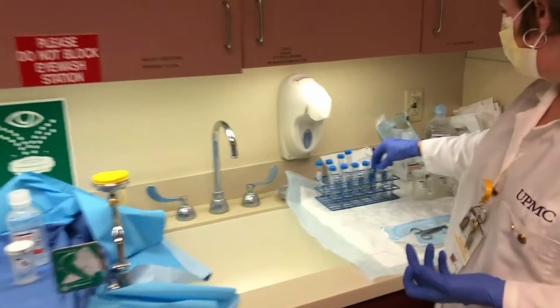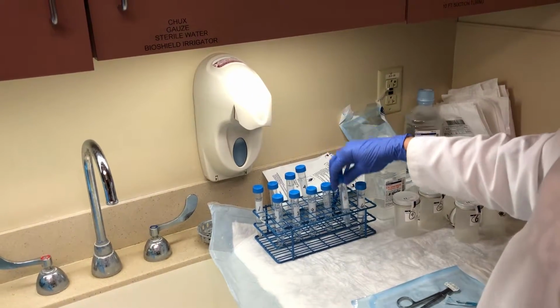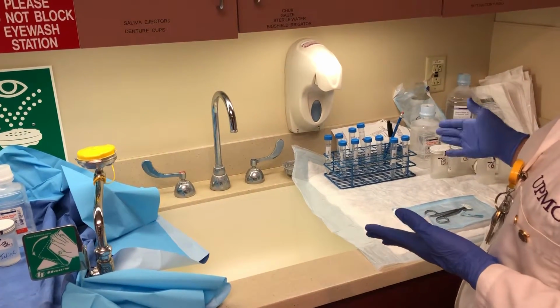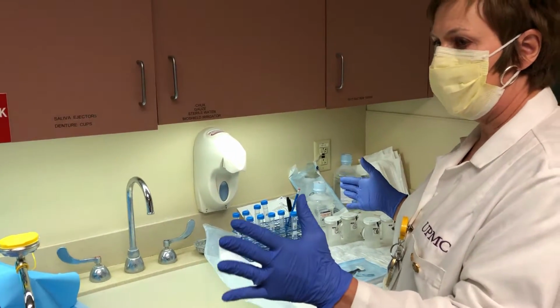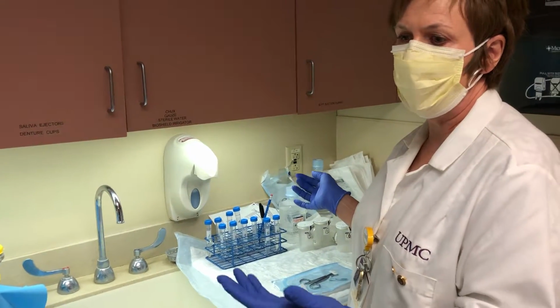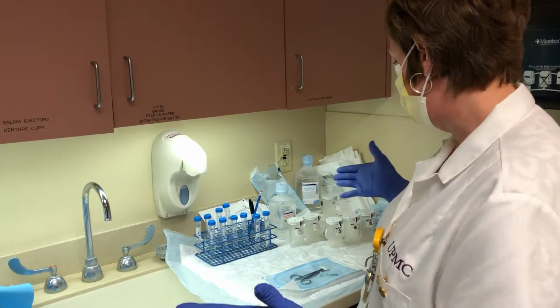We've got conical tubes filled with 5 cc's of the sterile saline, and you'll notice that these are all numbered because we're going to correlate the number of the tube with the serial number of the scope. So that's very important to keep track of that information so that when we send the specimens to the microbiology lab, we can correlate which scope goes with which specimen.